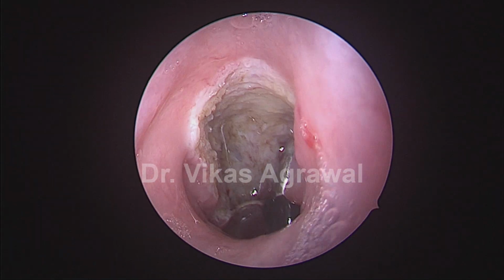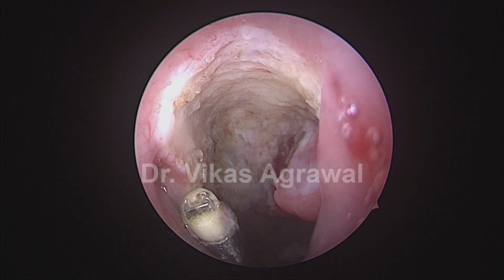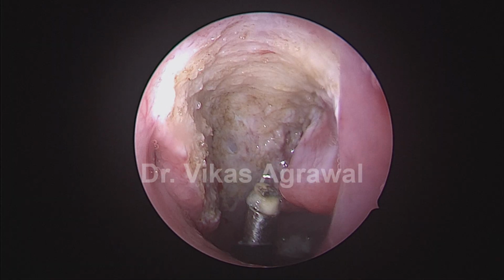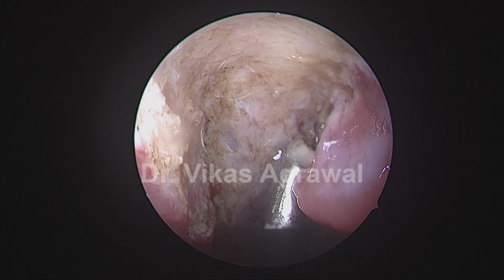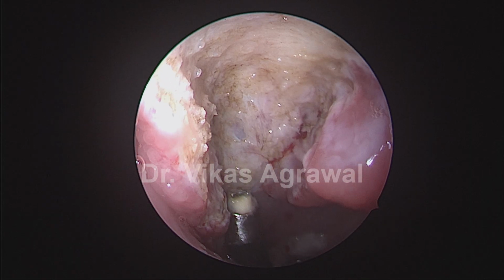These are the boundaries of the adenoid surgery. Superiorly, the periosteum below the sphenoid bone. Laterally anterior is the torus tubaris. Lateral posterior is the fossa of Rosenmuller. Posteriorly is the buccopharyngeal fascia. Now you see this wand has stopped working, so I'll have to simply change this wand. And inferiorly is the Passavant's ridge.